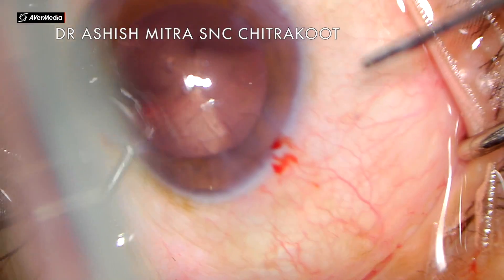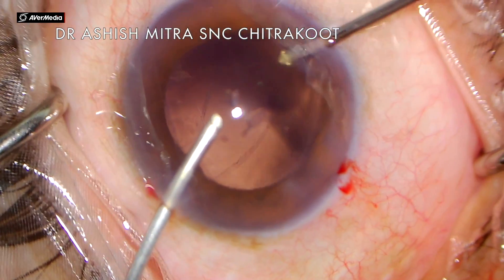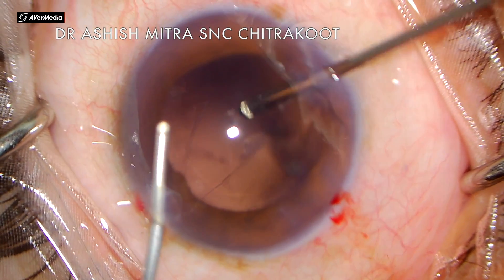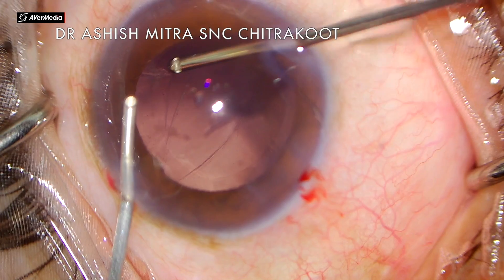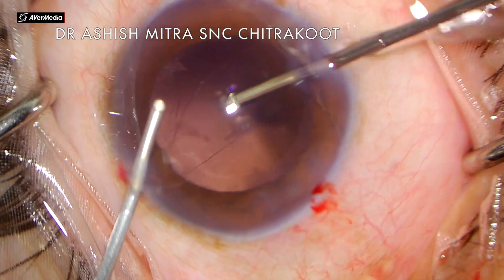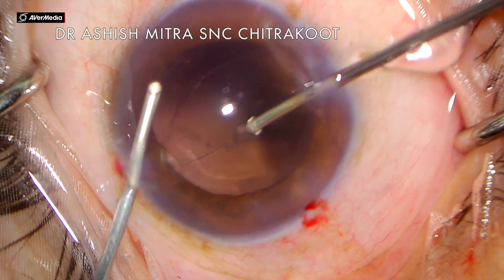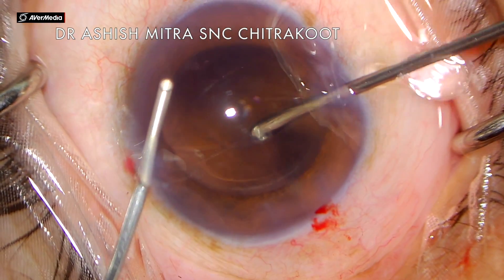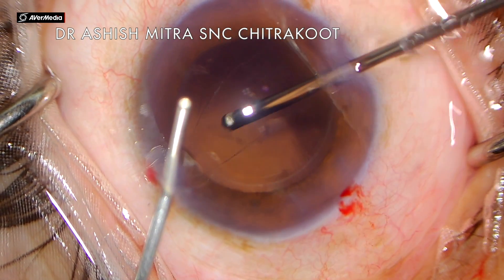What is advisable here is that you should be gentle and preferably aspirate fine cortex only in IA cut mode, where your cutter is at a lower rate — like 10 — and your vacuum is around 400. That is better than switching back to cut IA mode for these fine cortical remnants.